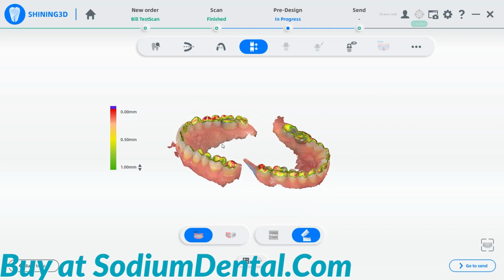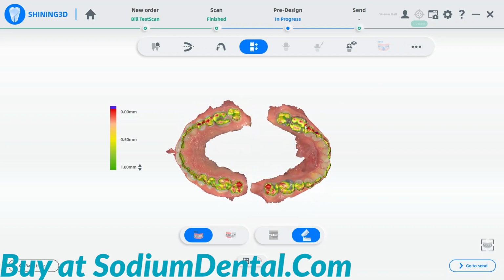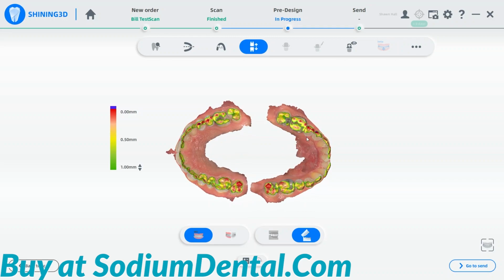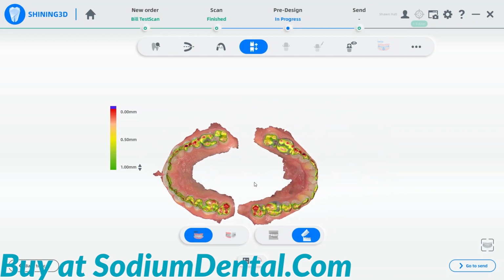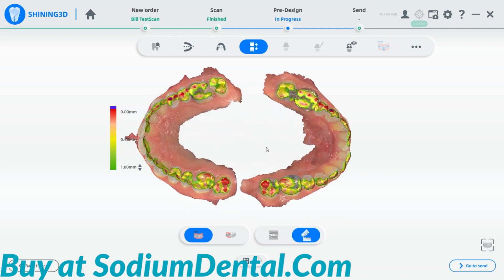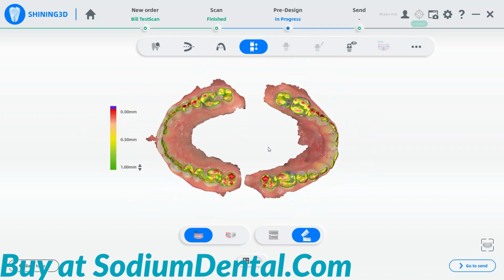Right-clicking and dragging will allow you to move the model in the space. Both mice pressed at the same time will allow a pan shift. Rolling the wheel mouse forward and backwards will allow you to zoom in and zoom out.